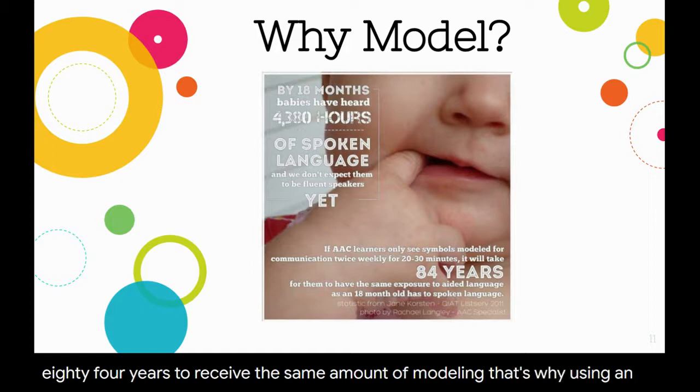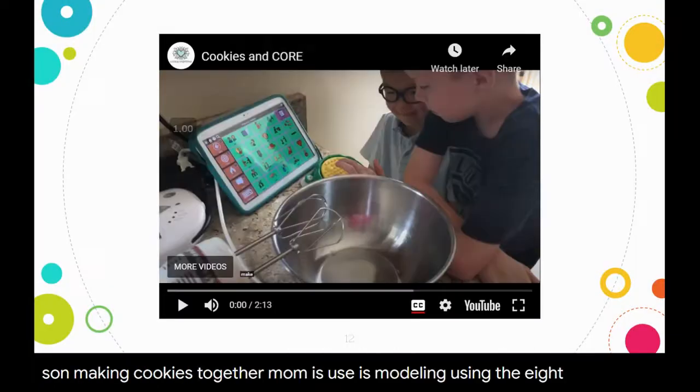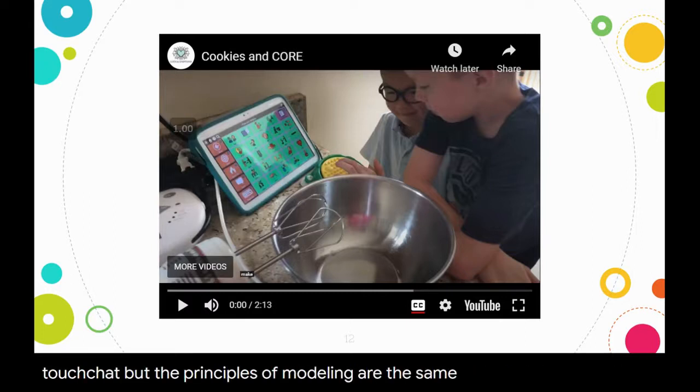That's why using an AAC device is an all-hands-on-deck intervention. Not only do we need support from the speech-language pathologist, we also need teachers and families on board modeling for students throughout the day, every day. This video shows a mother and her son making cookies together. Mom is modeling using the AAC device while they cook. This family uses a different AAC app than TouchChat, but the principles of modeling are the same regardless of the app.